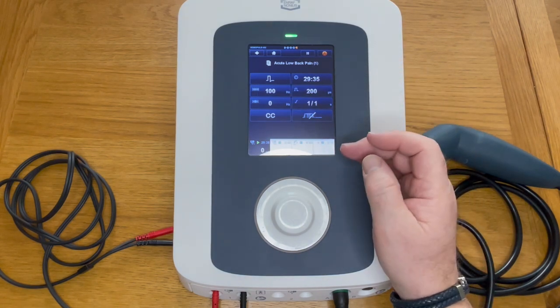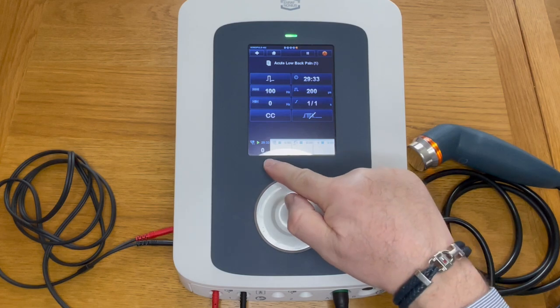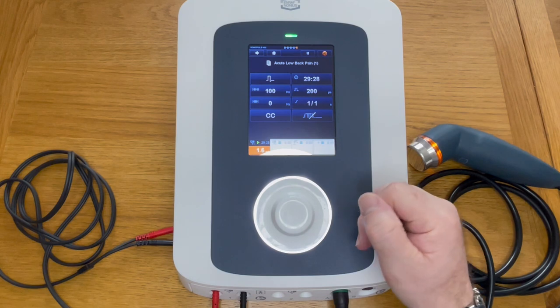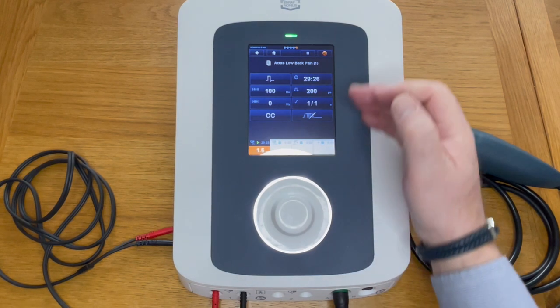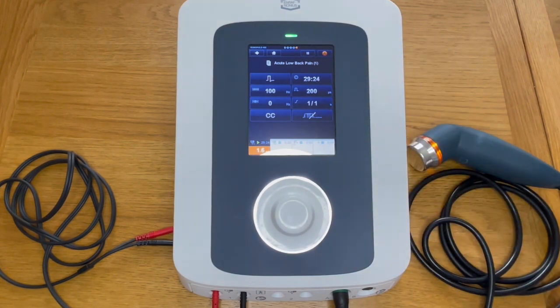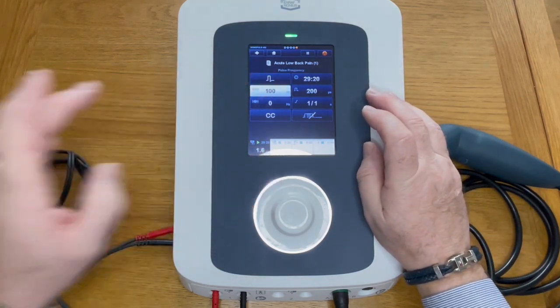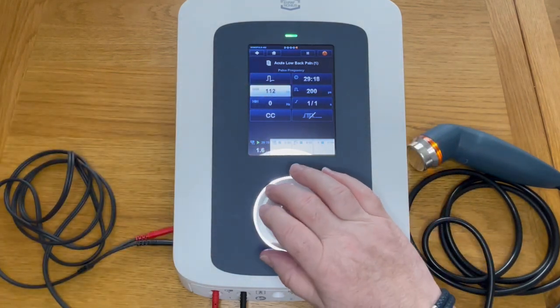Press the green tick again and it brings you back to the start — the intensity has returned to zero. Now place your electrodes on the patient, increase your intensity, and the timer starts to count down, confirming it's operational. At any stage you can change any of these settings by simply tapping them and adjusting.